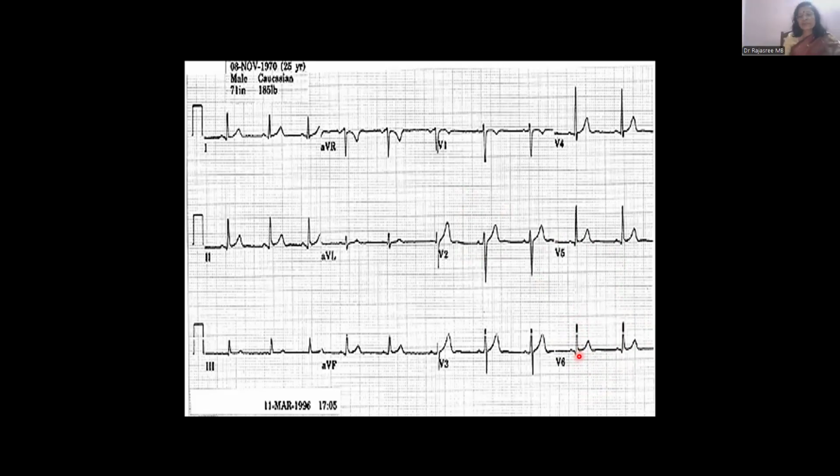Within that. So what is the possibility? Probably there is no significant ventricular enlargement. Correct, everybody? Yes, there is possibly no ventricular enlargement because the QRS amplitude is within normal limits. It's only about 15 or 16. If it is a ventricular enlargement, the QRS will be very tall. It will occupy more than 26 millimeters. It will be up to here. Because it's normal height, you are almost not thinking in terms of a ventricular enlargement.